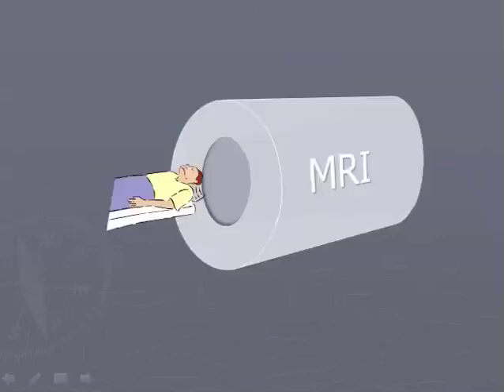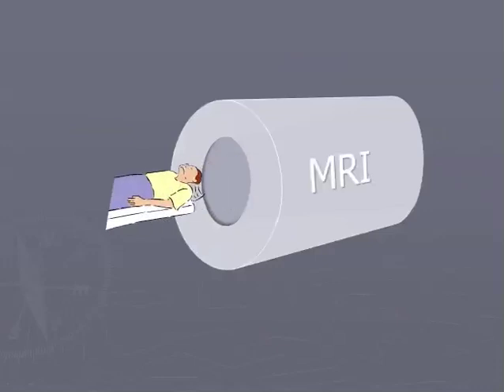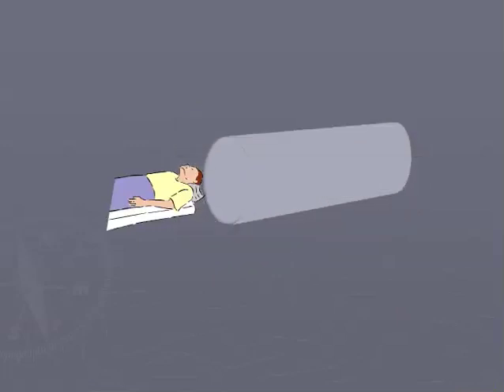Slide 14. The MRI machine is functionally a tube that the supine patient enters for scanning. MRI safety procedures are extensive, and placement of electrodes on the patient during the scanning process is but a small portion of the overall set of safety considerations. Let's go inside the machine for a closer look. Slide 15. Let's start from the inside out with the bore of the machine. Slide 16. The bore is the tube which the patient enters.